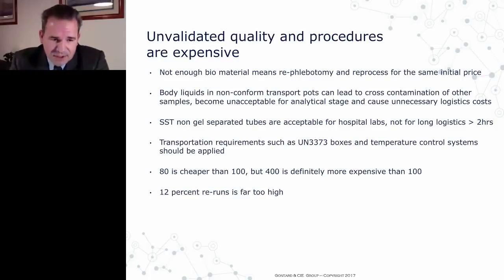To finish, the philosophy of reruns. We have noticed in the labs we take under management that there's a very high percentage of reruns, either because people go by the standard procedure but don't read it all the way to the end, or because they rerun the same tube on the same machine with the same lot number, with the same calibration, with the same everything. And guess what? Usually the result comes out exactly the same.